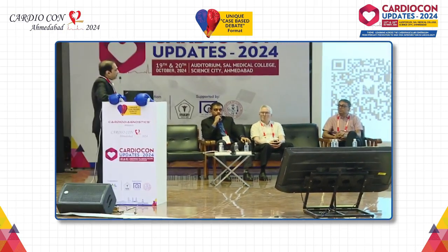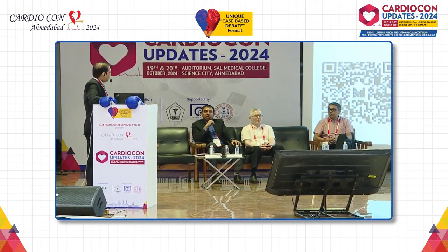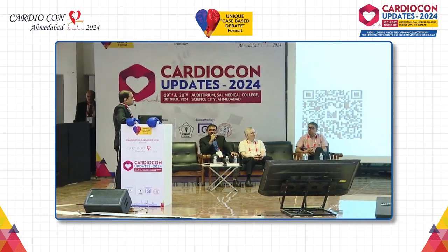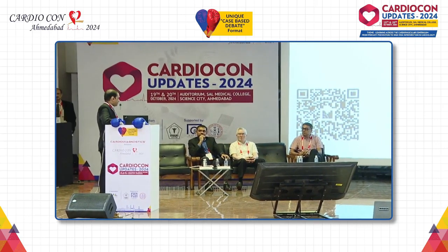There are patients where you have to combine not only both, then maybe you will have to post-stent, you will have to also use OPN balloon. So sometimes all three may be required and calcium may not go. So orbital is something that's going to be slightly different in the sense.